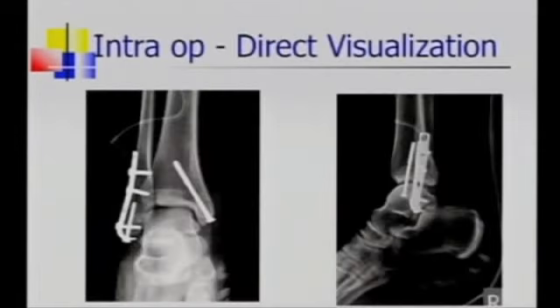Why? Let us see these points. This is how I have fixed the medial and lateral malleolus. Everything looks great because that was direct visualization.